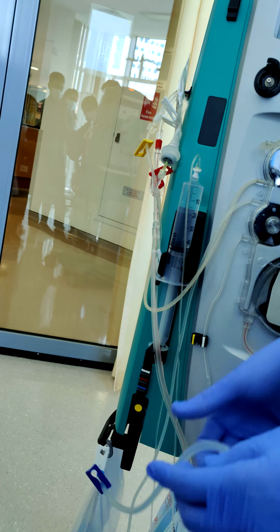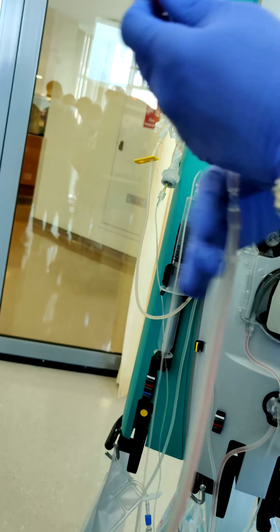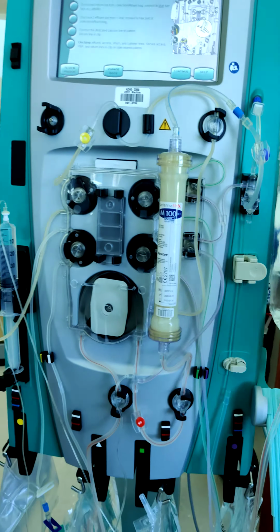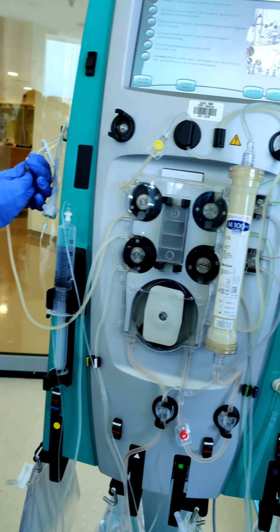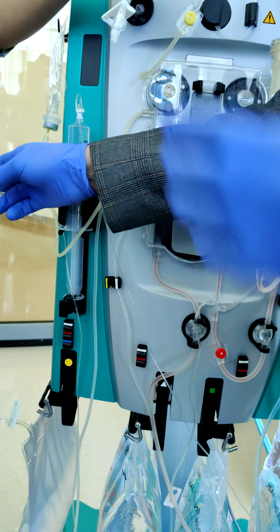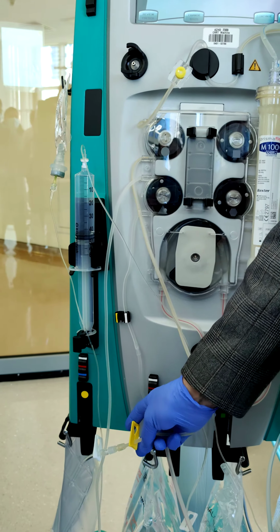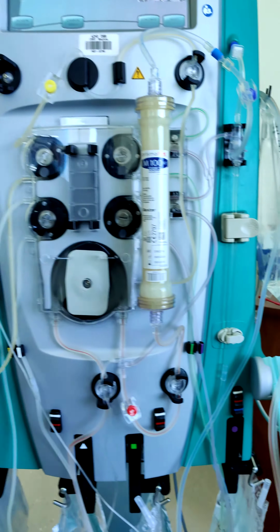Second step, remove the access line, the red one, connected with the catheter of the patient. Disconnect the return line connected to the catheter of the patient. Remove the blue one. Remove the yellow effluent line connected to the effluent bag, and unclamp the 6 clamps: 1, 2, 3, 4, 5, 6.